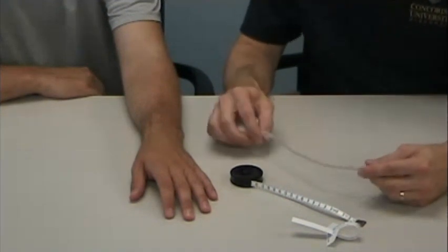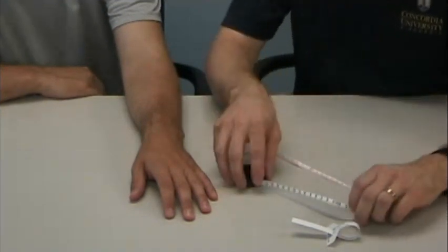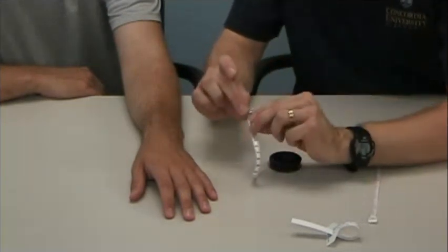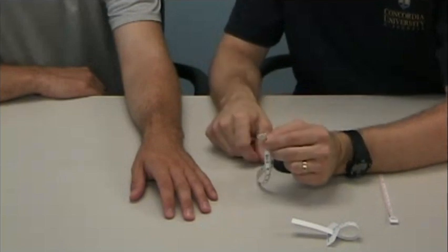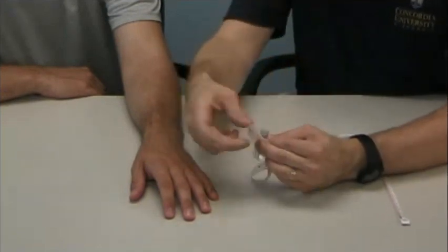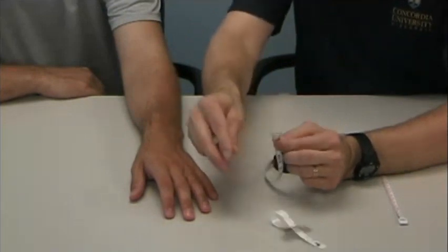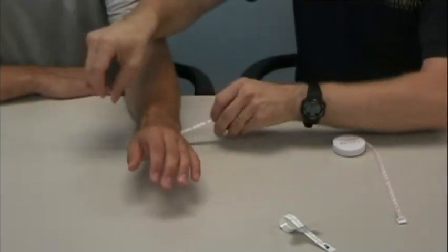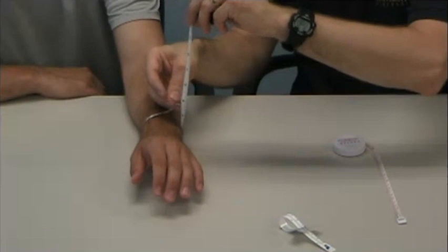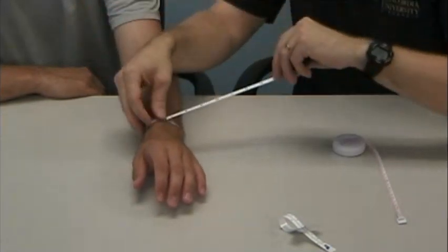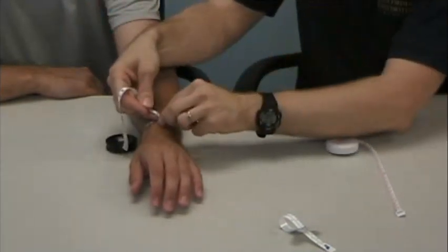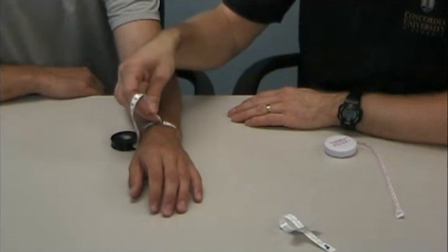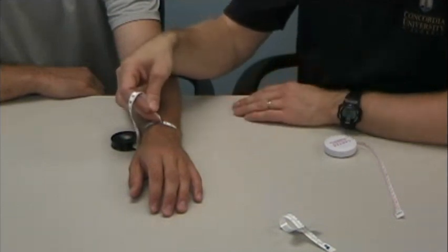For larger body parts, you can use a flexible tape measure, and there's a couple different ways to do that. Some of these flexible tape measures actually have a little device at the end that will hold the tape measure much like this held the tape measure for the finger. I can put that around, and then you just slide the tape measure into that part, pull it back and pull it snug. In this case, just proximal to his ulnar head, he's got about 16.8 centimeters of circumference.